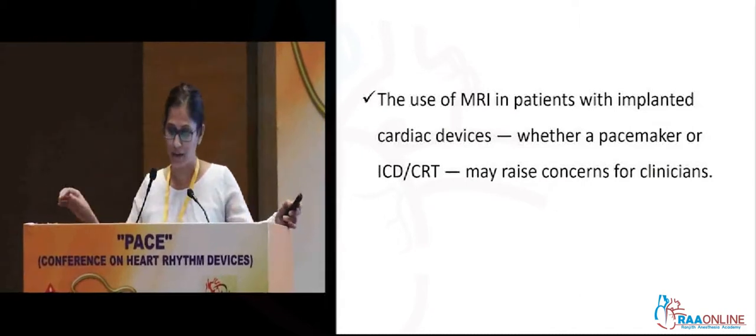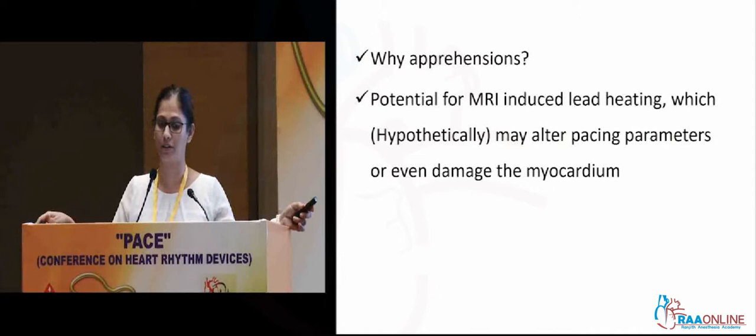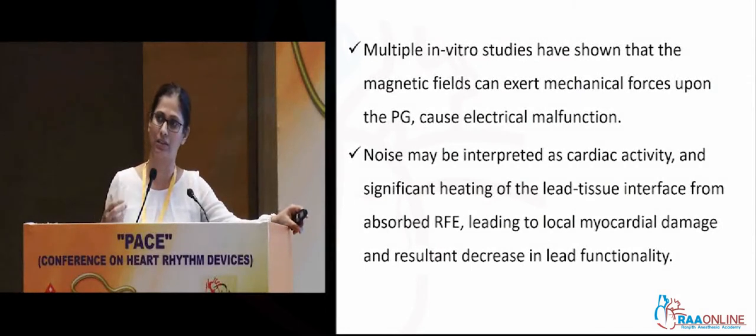Now the use of MRI in patients with implanted cardiac devices, whether a pacemaker or ICD or CRT, may raise concerns for the clinicians. And why we all have apprehensions about it. Why we have the apprehensions? Because of the system, the pulse generator, the leads, the ferromagnetic.